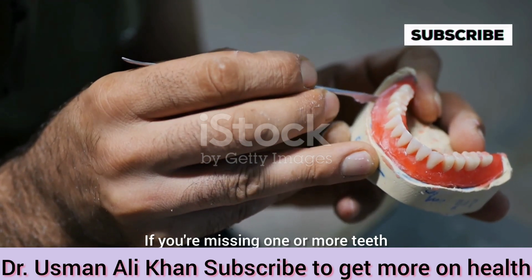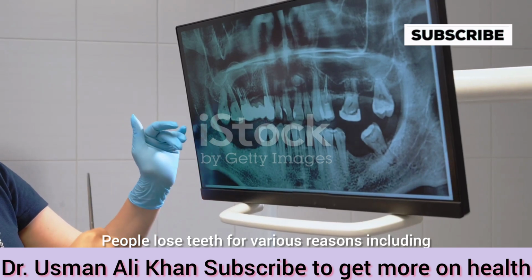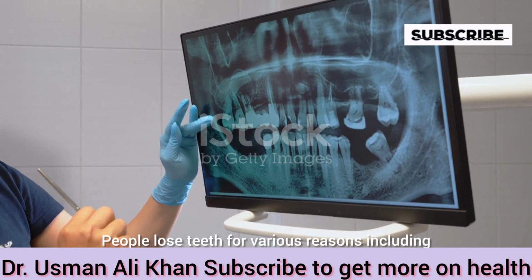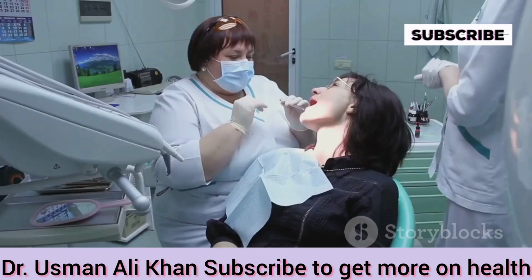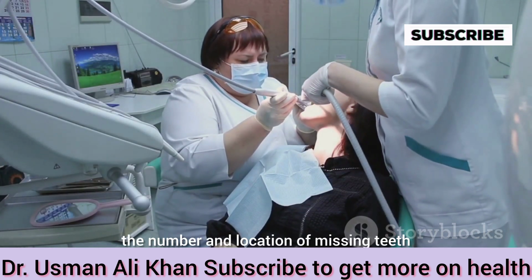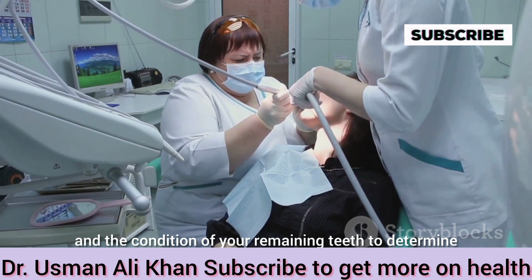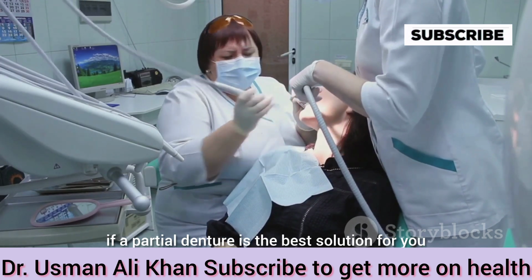If you're missing one or more teeth, you might be a good candidate for a partial denture. People lose teeth for various reasons, including tooth decay, gum disease, injury, or age. Your dentist will assess your oral health, the number and location of missing teeth, and the condition of your remaining teeth to determine if a partial denture is the best solution for you.